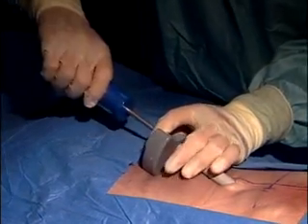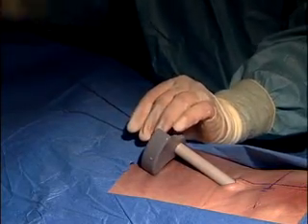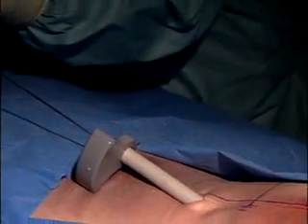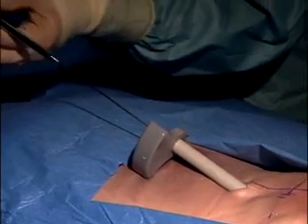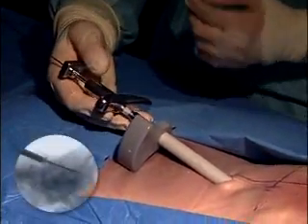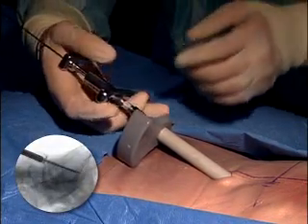After the proper position of the distal tip has been established, the driver is removed by pulling straight back. The compression tool is passed over the K-wire and onto the pull pin. The device is designed to compress a maximum of 10 mm, but the actual amount of compression needed is determined by the patient's anatomy and the surgeon's preference.